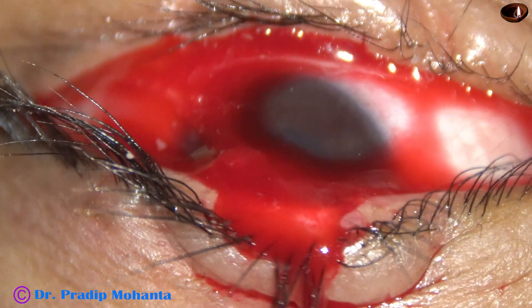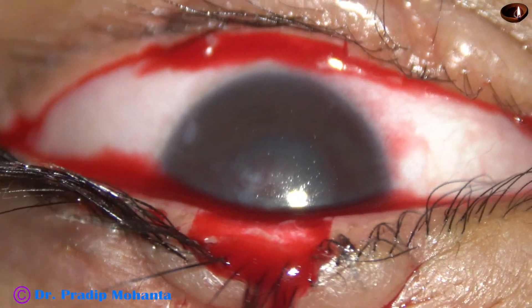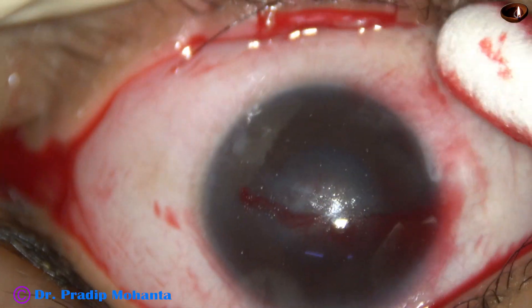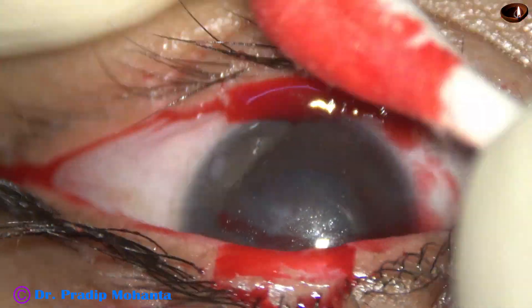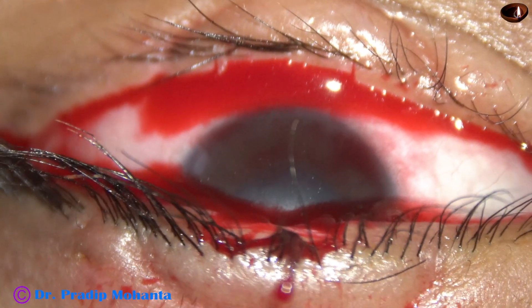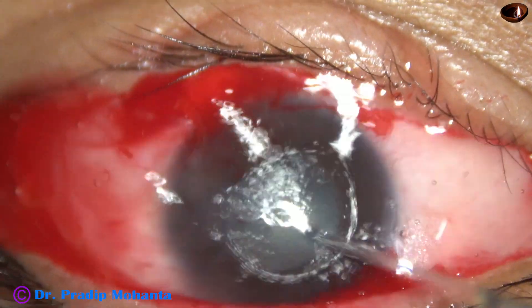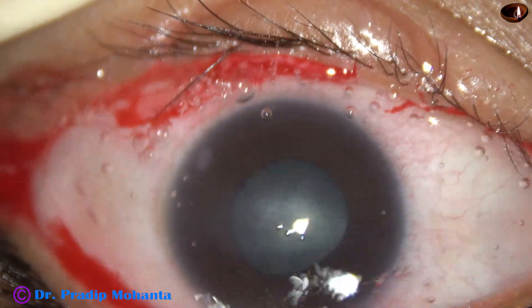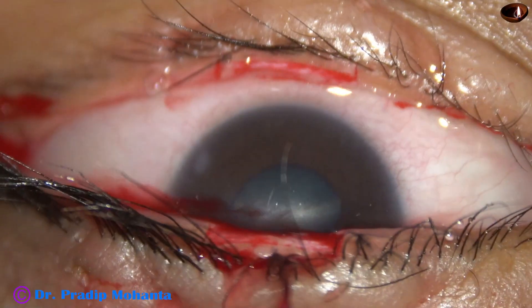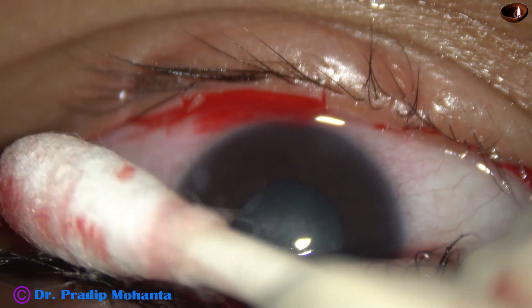So we have got the raw surfaces. Let it bleed — I don't use cautery usually. Now these two raw areas will be opposed to each other, new tissue will grow, and these two eyelids will get adherent to each other. The exposed cornea will get healed, and we will see that in this video itself.